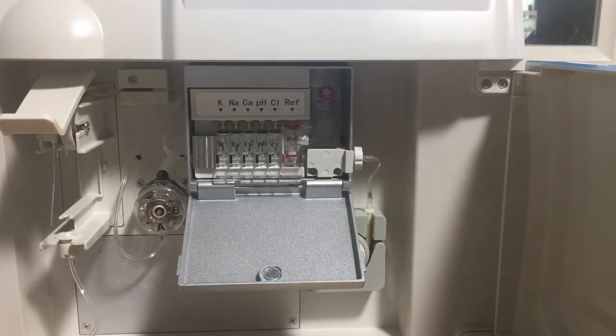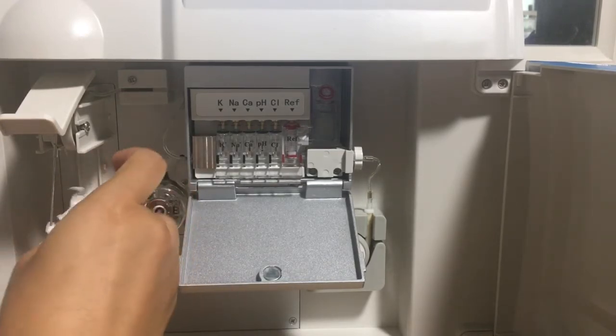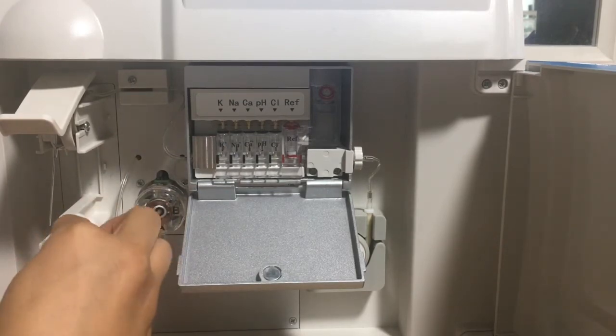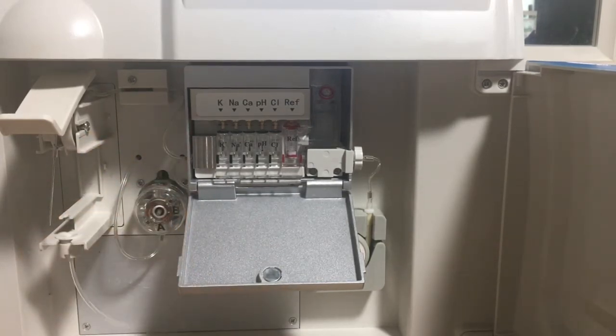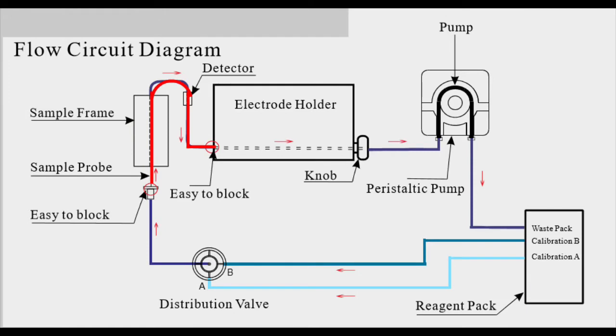We can see water coming out from the sample collector. We use tissue to clean it. If water comes out, it means this part has no blockage and is okay.